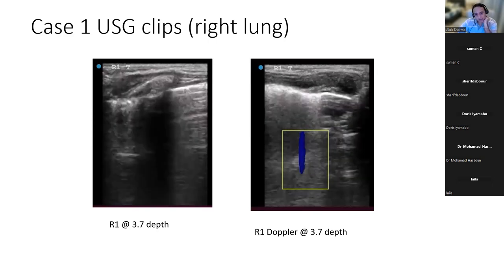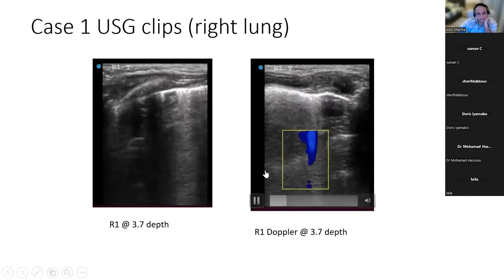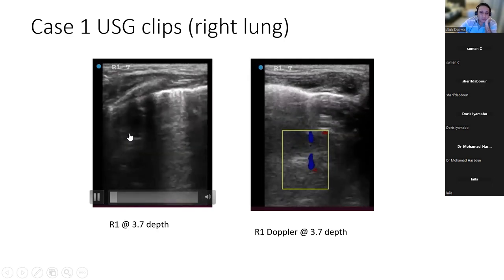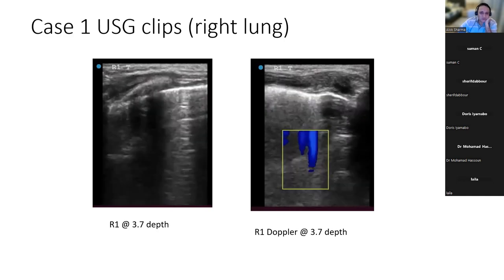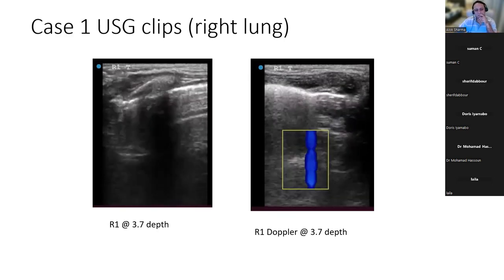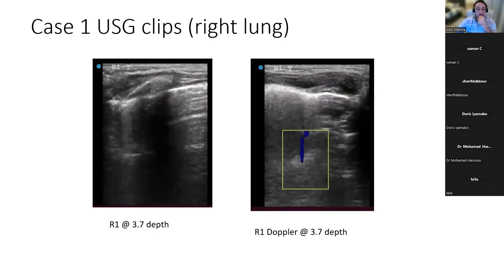But for me, what was important is that region on the right side. Go to R1 again on the left. No, the other image. Can you see that region? That's where you want to do Doppler. You need to Doppler that entire region. As I said, you've Dopplered the region below it, which is a consolidation, which is why it's giving you that appearance. At the outset, I did say that my hand probably was not stable and I had moved away, so I couldn't get the right place to do the Doppler.